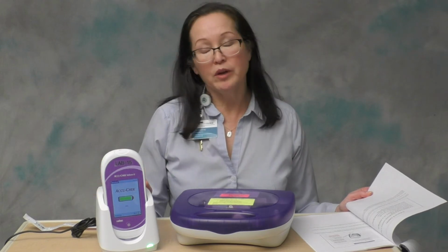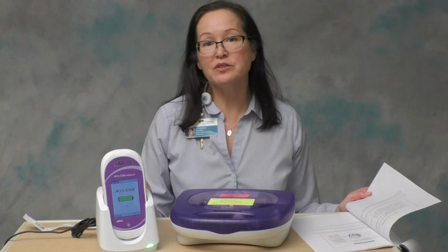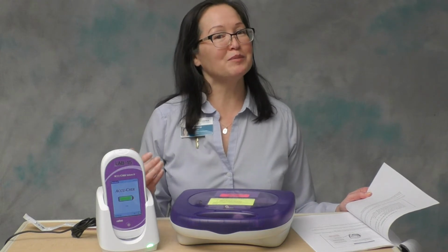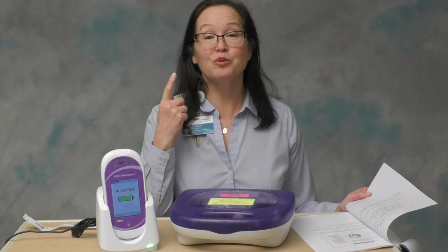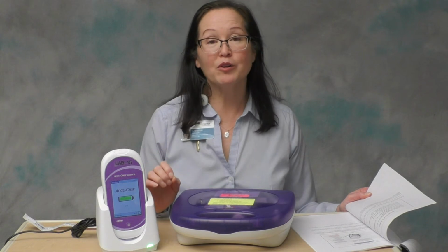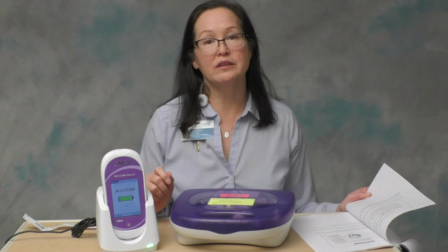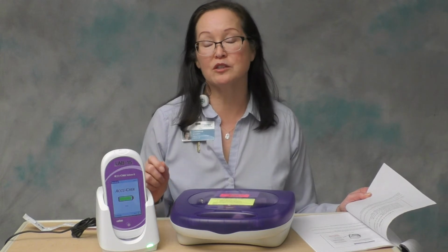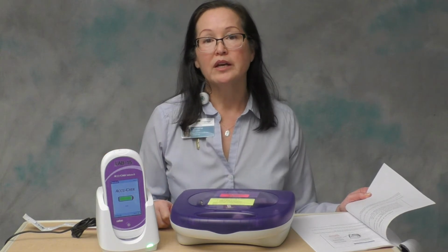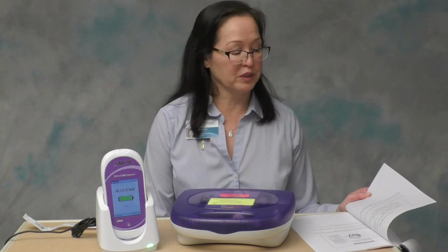The instrument has a reading range of 10 to 600 milligrams per deciliter. It requires a small sample size of 0.6 microliters. I always like to stop at this point and ask the group if they have a visual image of what 0.6 microliters looks like. So I'm just going to tell you it is smaller than a pinhead. So you should never be putting a full drop on the reagent test strip. That's a sure way of possibly contaminating that test strip port. So keep in mind your dose size is smaller than a pinhead, 0.6 microliters.